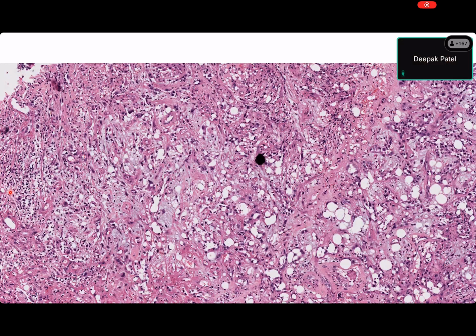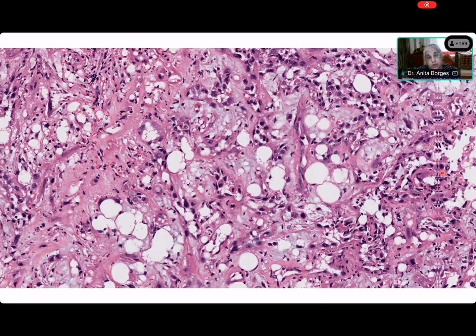Mesenchymal differentiation. It's a mesenchymal pattern, yes. So that's what you are seeing, something that is looking very sarcomatoid. Until you go to the right-hand side of this lesion, and there you see something else. What are you seeing there, Deepak? This is the right-hand side of that picture. What are you seeing? Yes, there is a mesenchymal pattern. I'm absolutely happy that you saw the mesenchymal. Look at these, these are all spindle stellate cells. Okay, but what are you seeing here? Sakshi, what are you seeing?